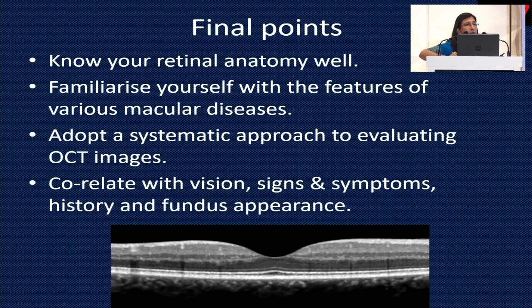So finally, whenever you're looking at OCT, you should know which disease may show which features. You should go systematically through all the points and always correlate clinically with the clinical pictures and the disease symptoms. Thank you.